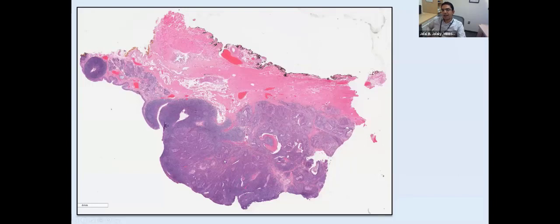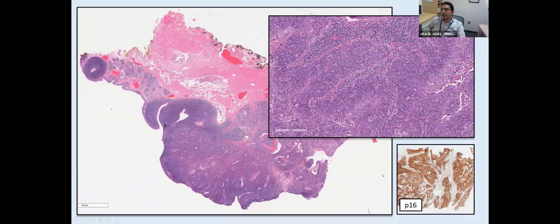This patient indeed had a squamous cell carcinoma involving the base of tongue and the tonsil. And you can see here the tonsillar epithelium that is not involved by tumor, and you can see here the crypt epithelium where usually the HPV infection happens and leads to a non-keratinizing squamous cell carcinoma that we see here in this case, and this indeed was HPV related, as you can see here, by the positive HPV p16 testing, which is a surrogate marker for HPV.